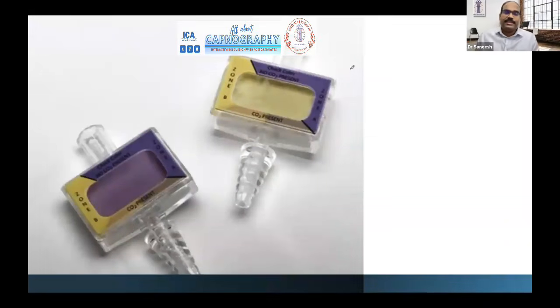Okay, so this is another equipment. If you see, the connector part is different. Where is it used? This is again working on the same principle, detection of carbon dioxide with the color change, the colorimetric method.